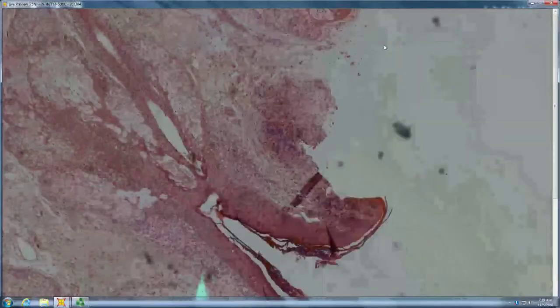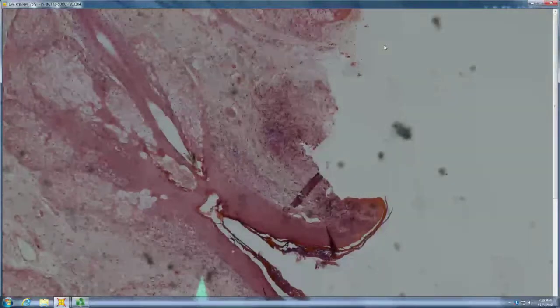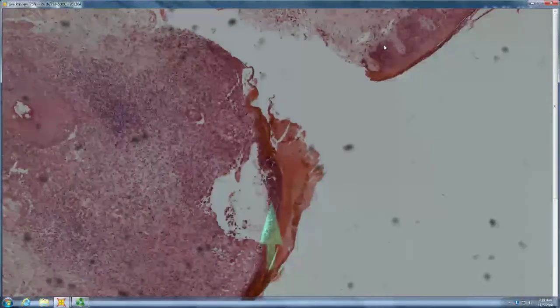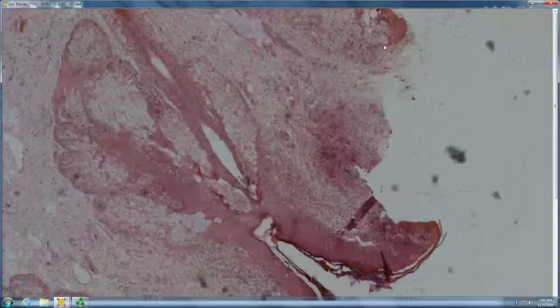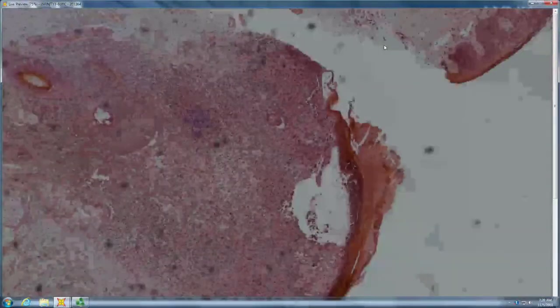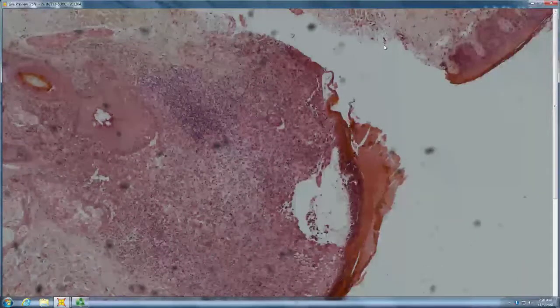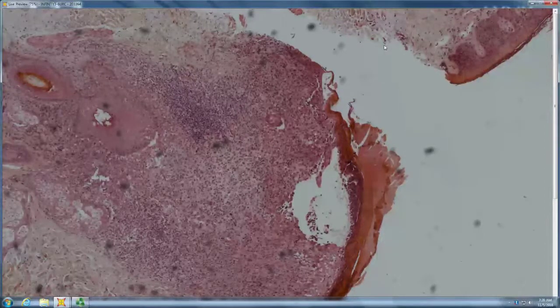Okay. So, Ahmed, what do you see? I see suppurative inflammation around the level of... So there's definitely suppurative up high. And what part of the hair is it attacking? This is a tricky one. Is it the deep part or the superficial part of the hair follicle? Superficial part. Which we call the infundibulum. So this is something attacking the infundibulum, right?